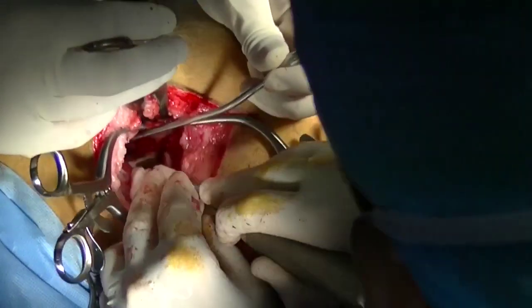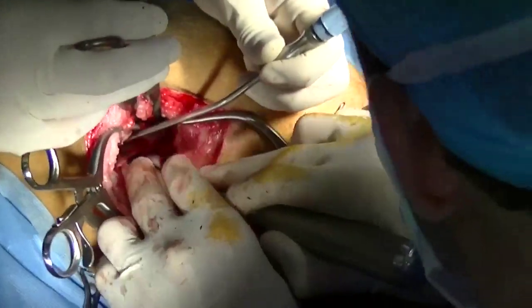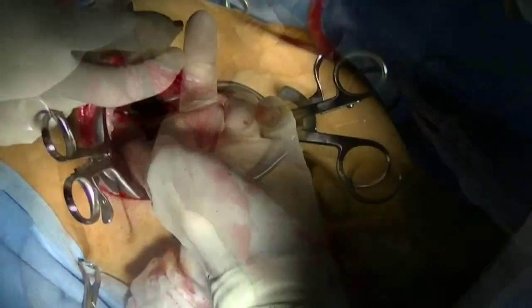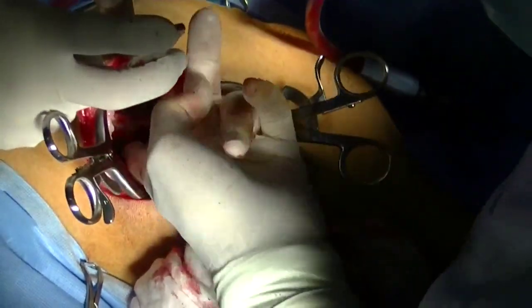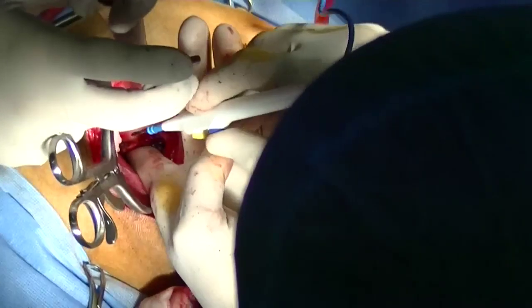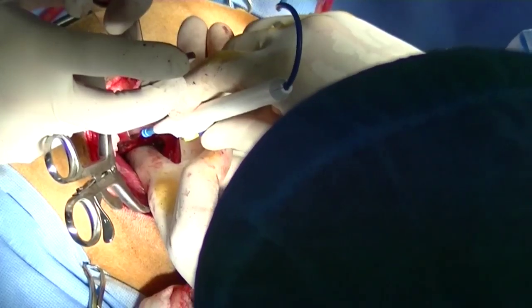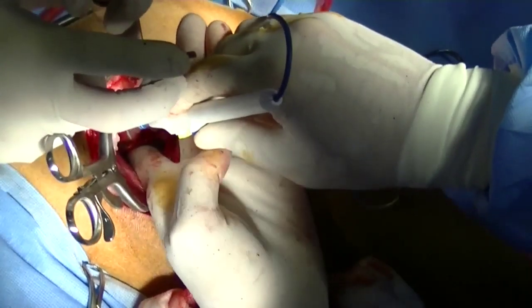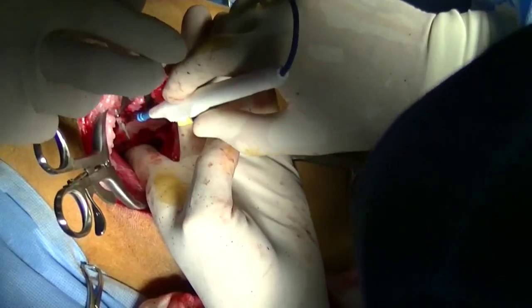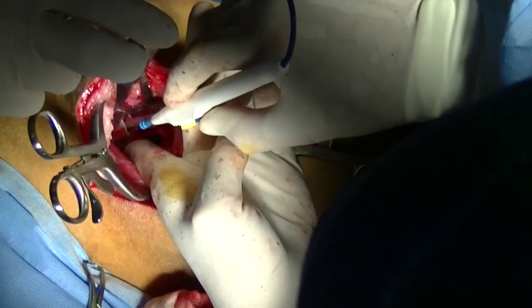The periosteum is separated away from the medial portion of the ileal wing and then a gauze sponge is placed. I like to stick my index finger in medial to the ileal shaft and identify the caudal-most extent of the sacrum or the sacral wing, and then I make a mark using my electrocautery to serve as a pattern for my osteotomy.